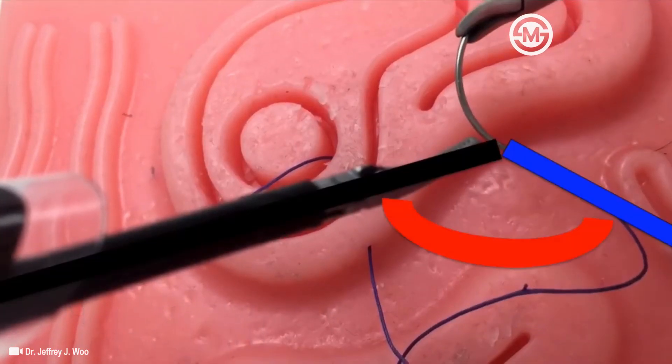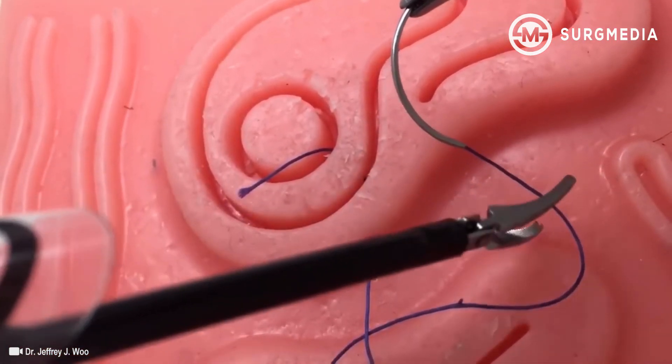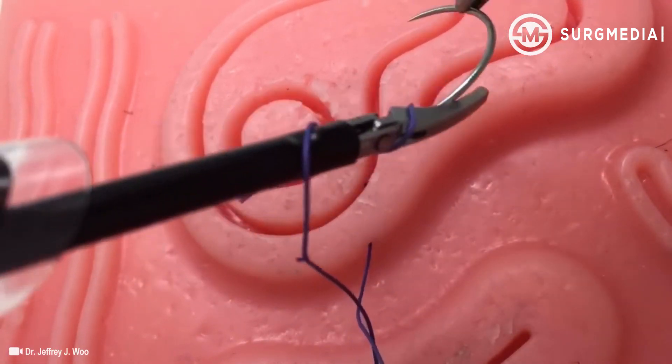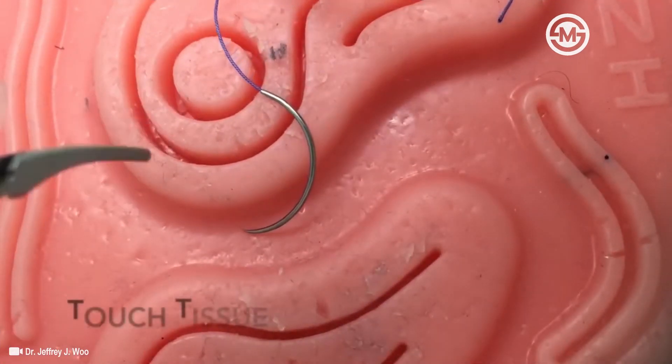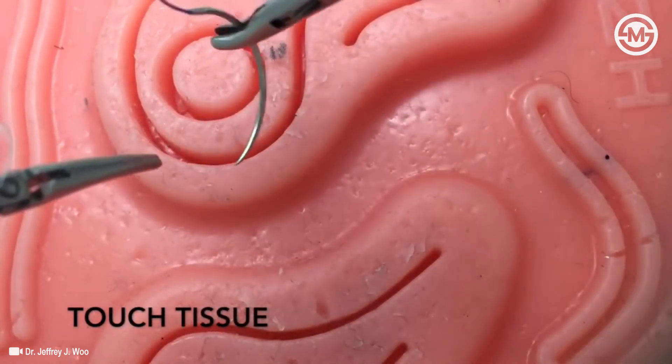As shown, touching tissue will help you overcome the two-dimensional display in a three-dimensional environment.